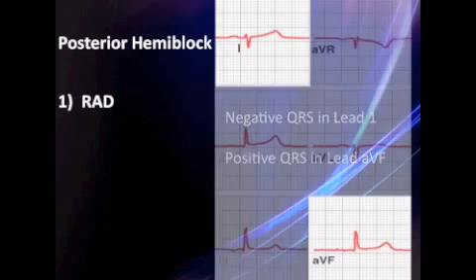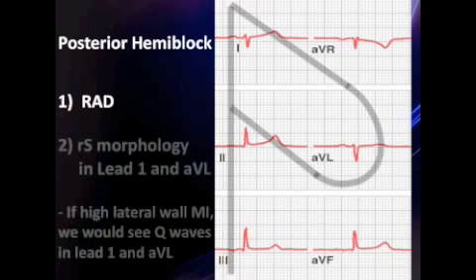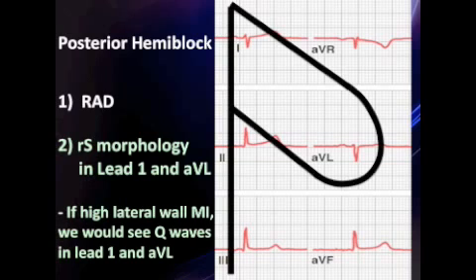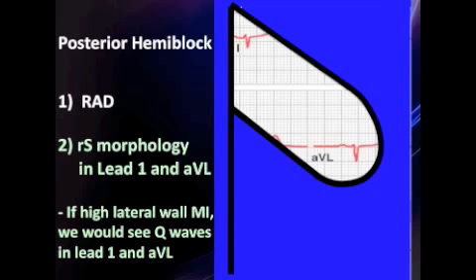And secondly, we have RS morphology in leads 1 and AVL. How do I remember that? By drawing a funny-looking P for posterior. And why look at these leads? We want to rule out a high lateral wall MI. If that's present, you'd have Q waves in leads 1 and AVL — which we do not see here.